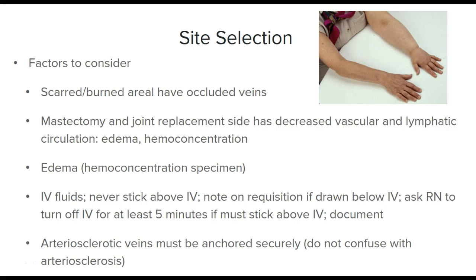Arteriosclerotic veins, these are veins that have buildup with plaque in them, and they're kind of hard. So you've got to anchor the vein down so that you can get in it.